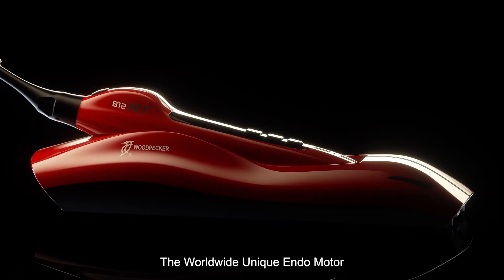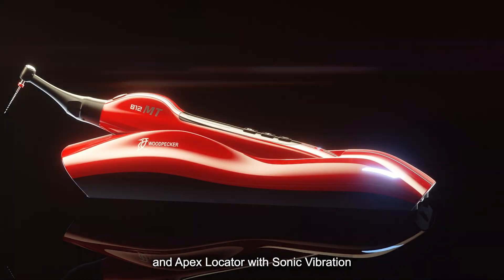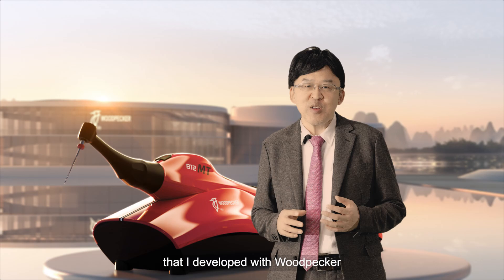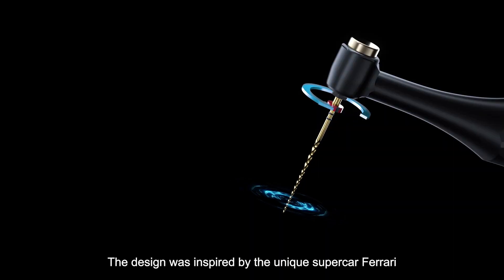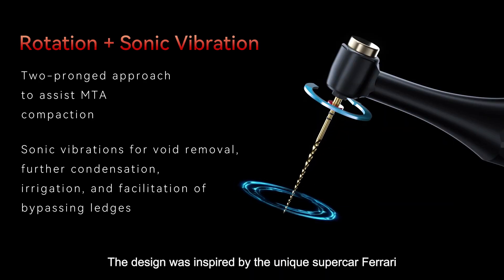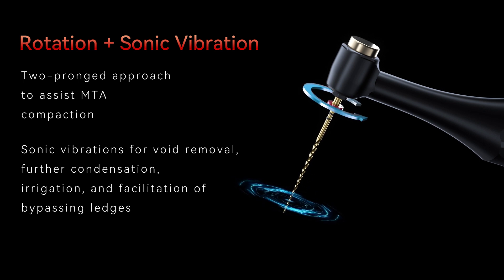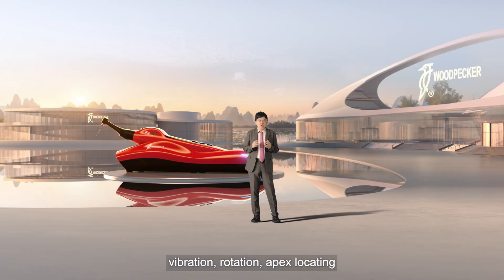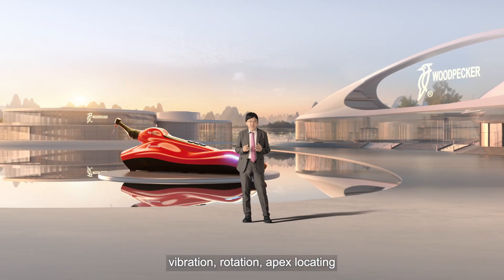The worldwide unique endo motor and apex locator with sonic vibration that I developed with Woodpecker. The design was inspired by the unique supercar Ferrari. It has three main functions: vibration, rotation, and apex locator.